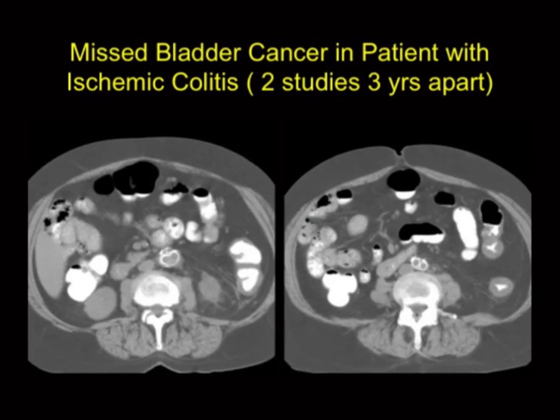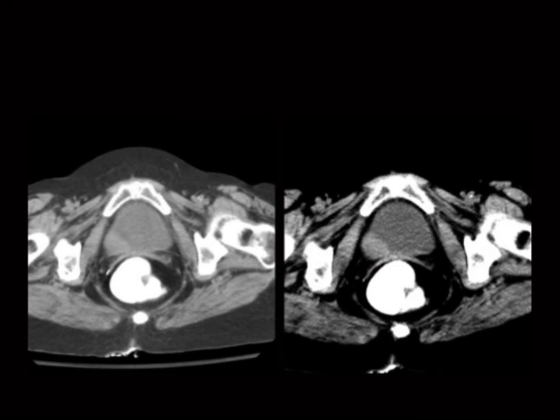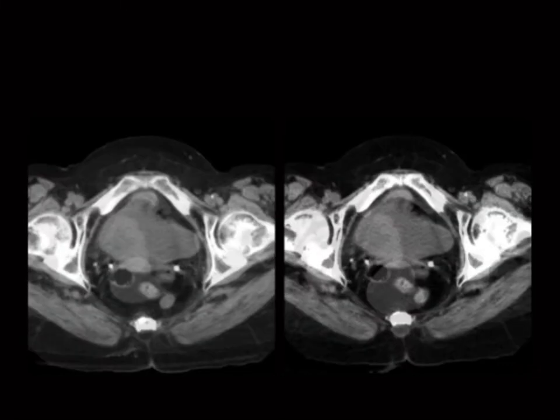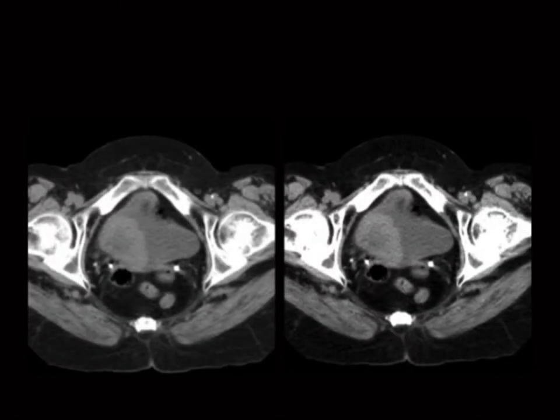I came across a legal case where a patient came into the ER with acute abdomen. The radiologist correctly said ischemic bowel, the patient had surgery. Three years later, the patient has a mass in the bladder. Going back to the scan from three years earlier — sure enough, around seven o'clock, there's a mass in the bladder. The study wasn't done for bladder cancer, the patient did not have IV contrast, but there was a soft tissue mass that is now twice as large, and the person won the lawsuit.